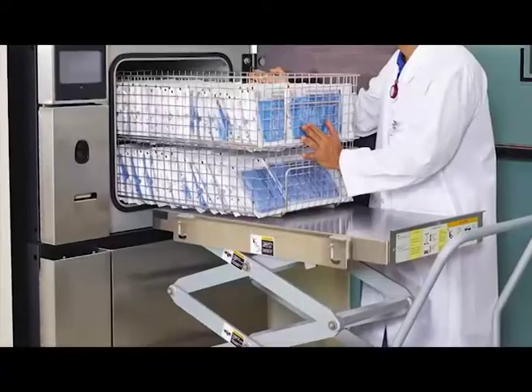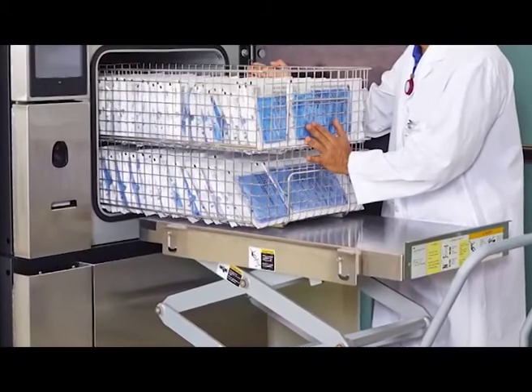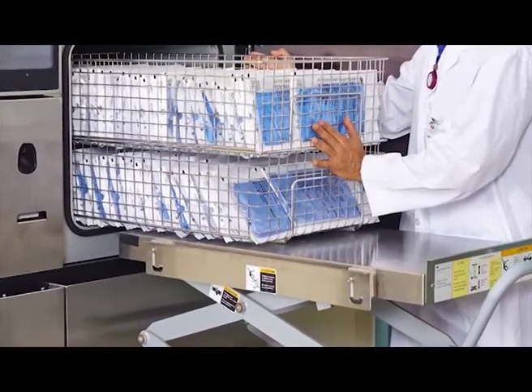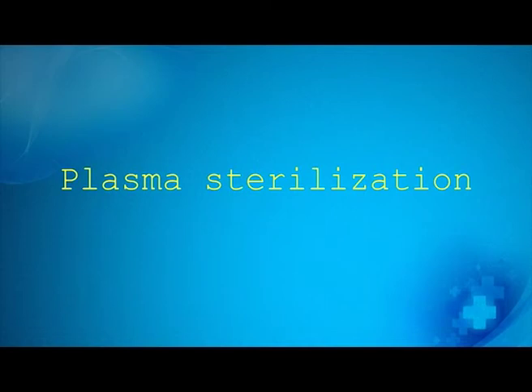After the product is sterilized, it has to be placed in a well ventilated area for 72 hours for quarantine aeration, to bring down the ETO gas residual level within acceptable limits. By this time, biological indicators also give the result of sterility of the sterilized load, and the sterilized products can then be used safely.